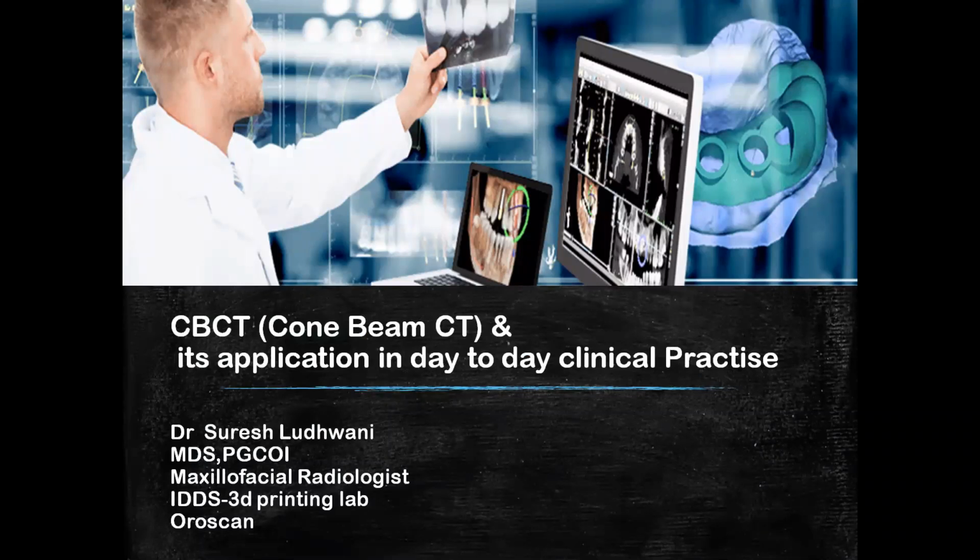Today, on behalf of Oroscan, we will be presenting a presentation on cone beam computed tomography and its application in day-to-day clinical practice. This presentation has been divided into two parts. One part will be taken by me, in which I will describe different applications of CBCT and how to read CBCT, and the other part would be a software demonstration by my colleague Dr. Neelip.